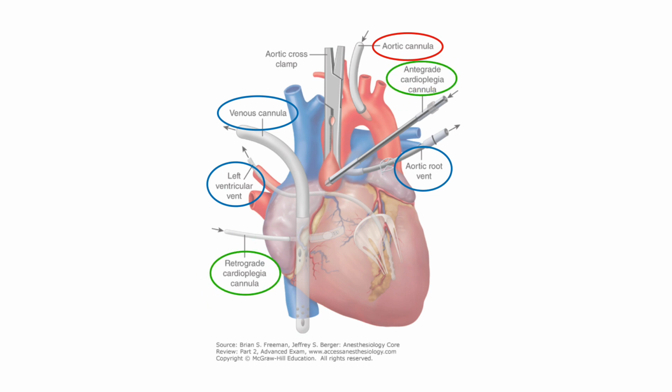After aortic cross-clamping, the heart will be stopped, or plegedd, using a high-potassium cardioplegia solution infused through an aortic root cannula and a retrograde cardioplegia cannula placed into the coronary sinus. The cardioplegia may be entirely crystalloid, but is more commonly a mixture of cardioplegia solution and blood.